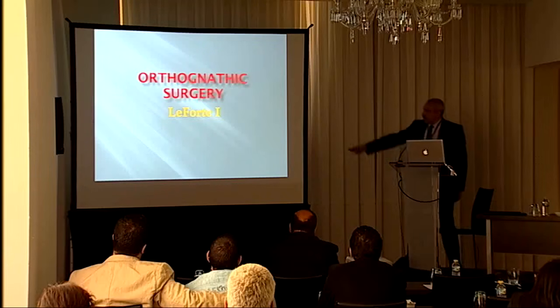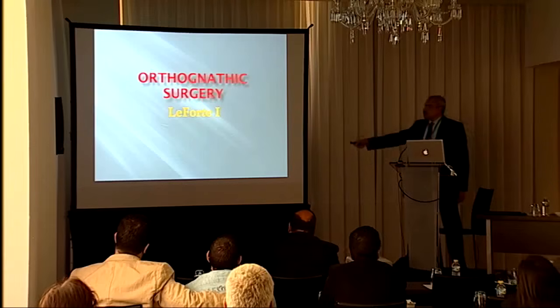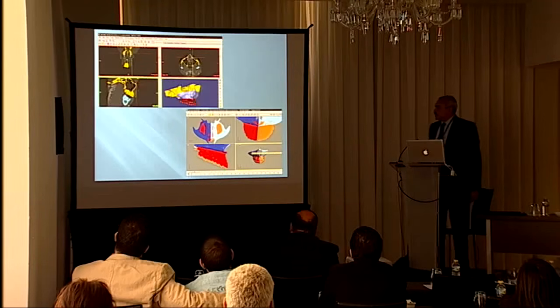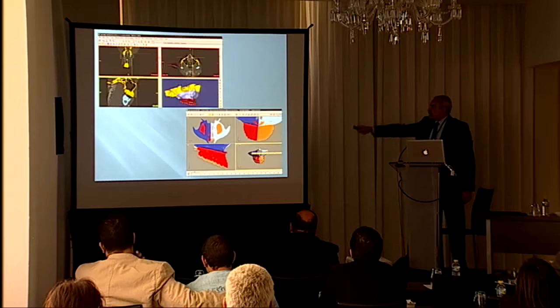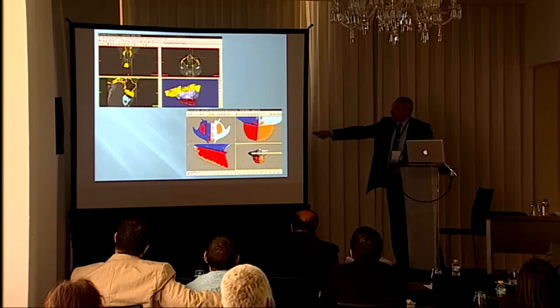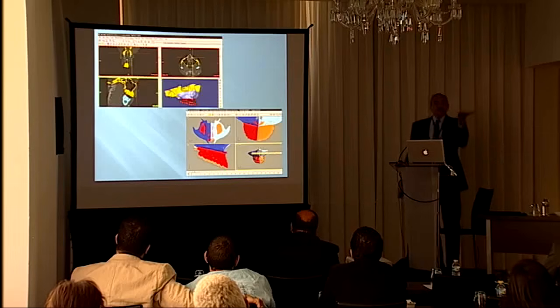Still active? Okay. To continue on orthognathic surgery, we tried to do a splint for the Lefort 1 osteotomy. After the analysis and stuff, we did the 3D model, and these are the 2D scan cuts. And this is the maxilla. And if you can see critically, this pink color is projecting through the nose. This is the maxilla after we move the maxilla upwards.